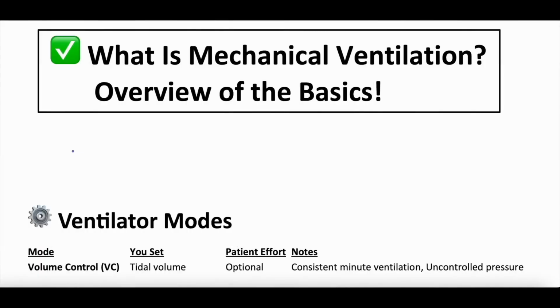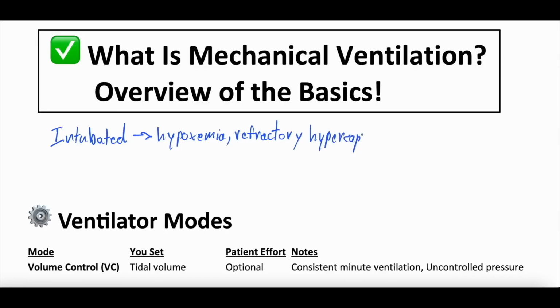Just as a somewhat introductory concept here, mechanical ventilation is obviously someone who has been intubated. They have an endotracheal tube. And intubation is a totally separate discussion, but the reasons for intubation tend to be things like hypoxemia, or low oxygen levels, refractory hypercapnia, or high CO2 levels, and inability to protect airway. So airway protection, that patient who is so altered that they're gurgly, they're aspirating, they can't protect their airway. Anticipated clinical course is another one.